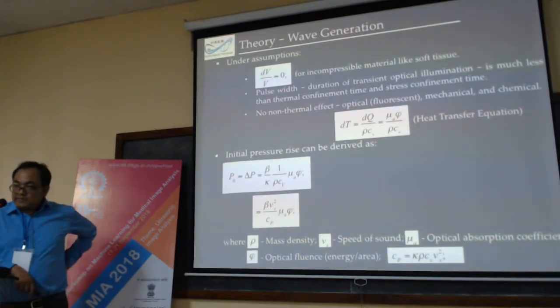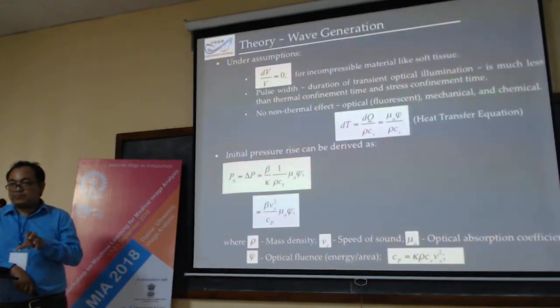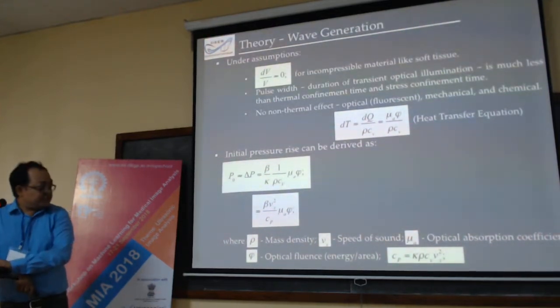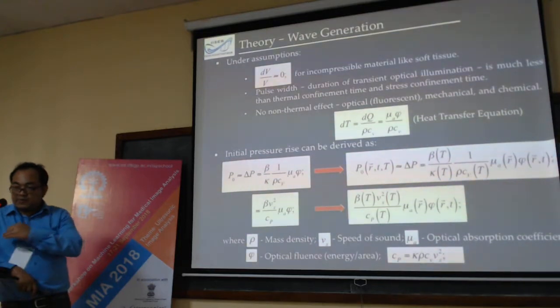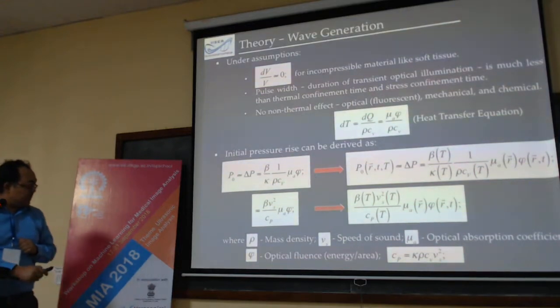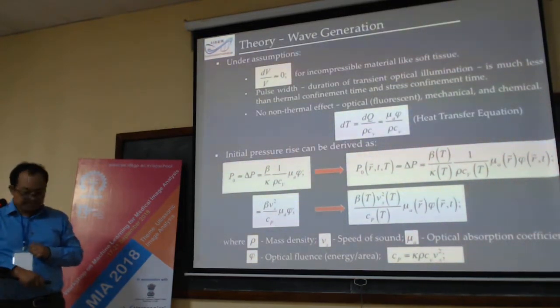So, photoacoustic imaging, I would like to break up into two stages. One is the generation of the acoustic wave, and another stage is the propagation of the wave. After the generation, I would like to discuss the generation and propagation of the acoustic wave. Let me tell you about this. If we are talking about the distributions, then I would like to represent this equation in terms of a quantity that depends on space, time, and temperature.